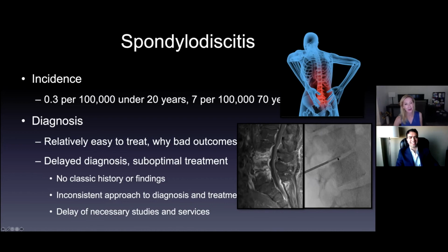I'll tell you a little bit more about the procedure for doing a percutaneous biopsy, kind of the technique to get the maximum yield, because it's often hard to get the organism. About 50% yield when we do it this way is the best we can do. And there are ways to maximize that.